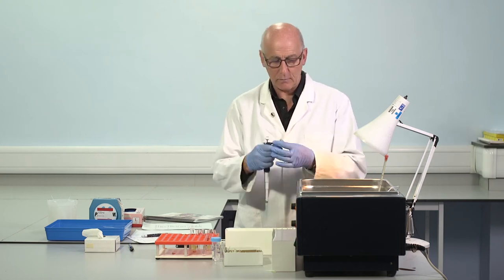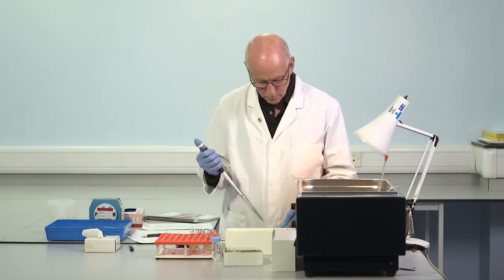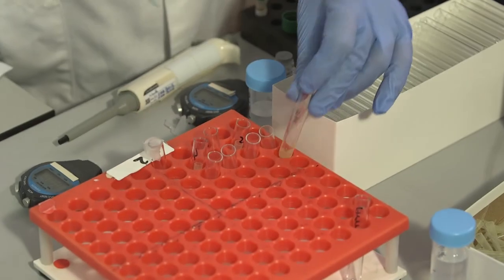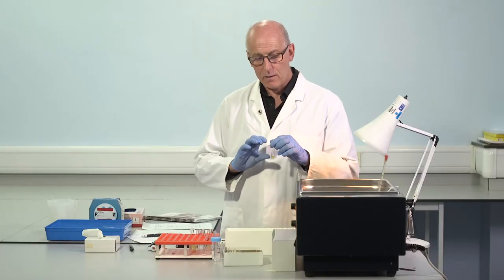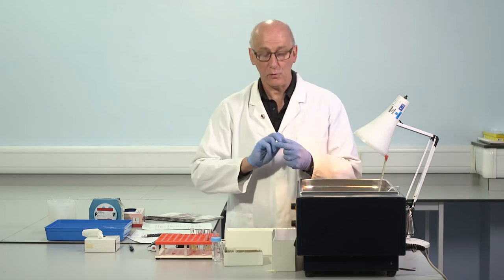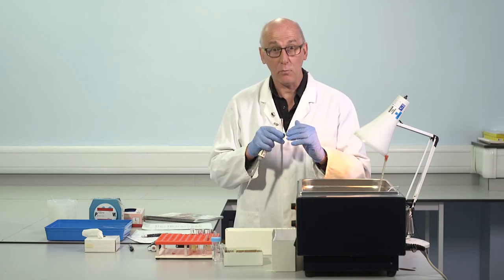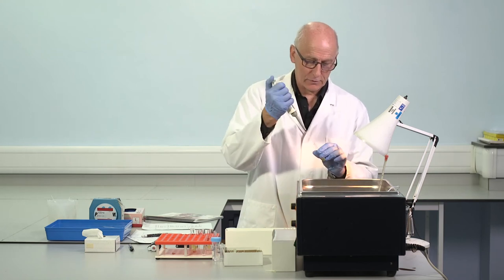Okay, so we have a pooled normal plasma, 1 volume, in this case 300 microliters, same volume of patient sample, this is patient number one, and mix. So we've diluted 1:1 patient with pooled normal plasma. So if the patient sample is missing one of the clotting factors, we will now provide it from the normal plasma that's been added. So now the APTT is the same. Let's get this moving along and we'll just keep talking.